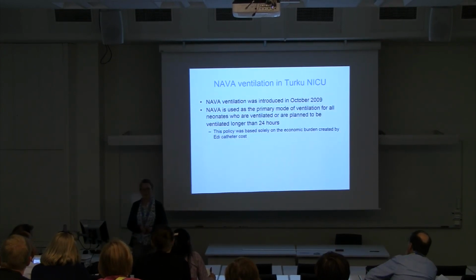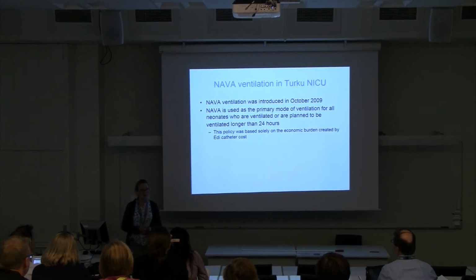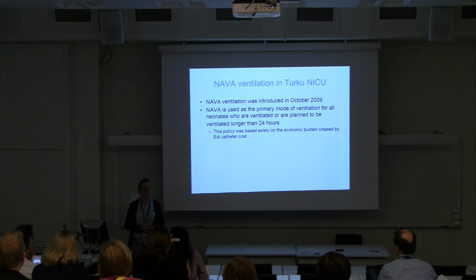So we started NAVA in October 2009, and we are using it as our primary mode of ventilation for all neonates who are ventilated or whom we plan to ventilate more than 24 hours. And this is because of the cost of the EDI catheters, that we don't insert the catheters to those patients that we intubate and give surfactant and plan to extubate shortly.